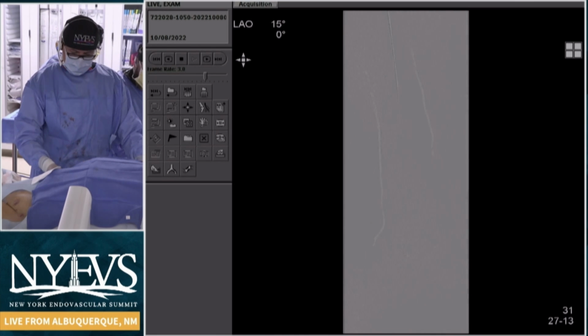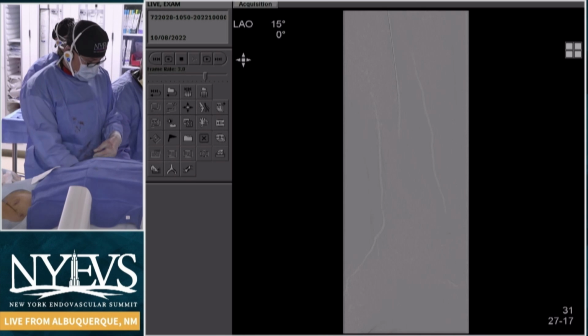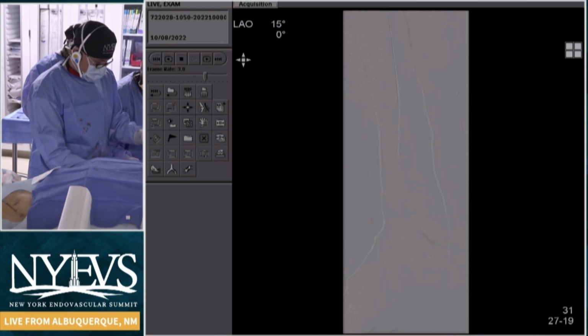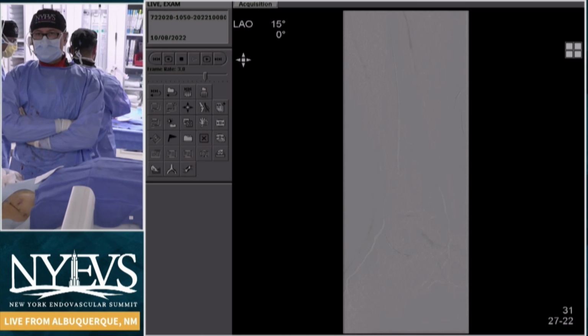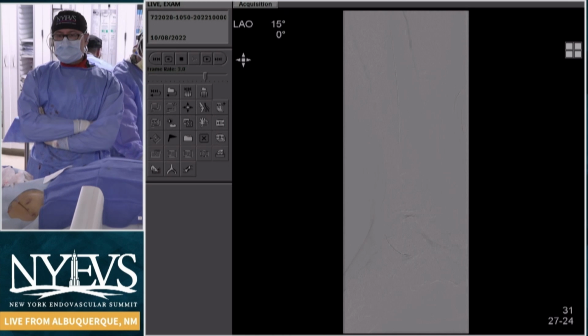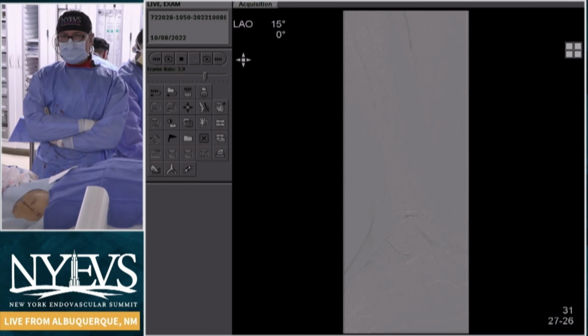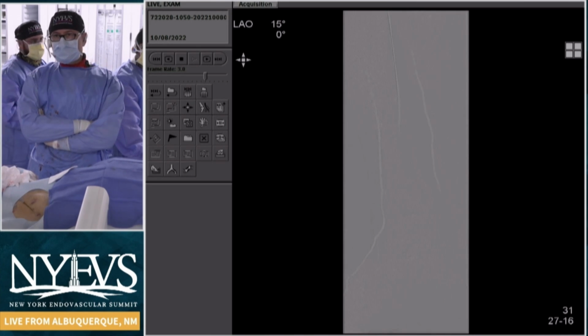The other thing to keep in mind is that the patient didn't get like this overnight, so they don't have to get fixed overnight. You can be patient and just kind of see how things go. Yeah. And I think a nice Doppler or duplex ultrasound of the DP, PT, et cetera, there's your endpoint. You guys, as surgeons, do this all the time, just like a lot of busy CLI operators do. And so you can look and see if your signal is significantly better. Maybe it's biphasic at this point instead of monophasic or instead of absent. So a lot of options.